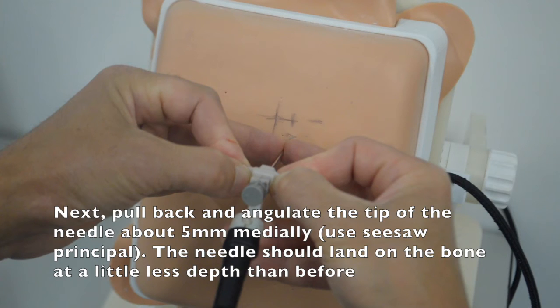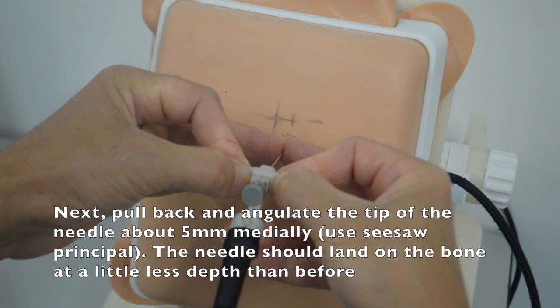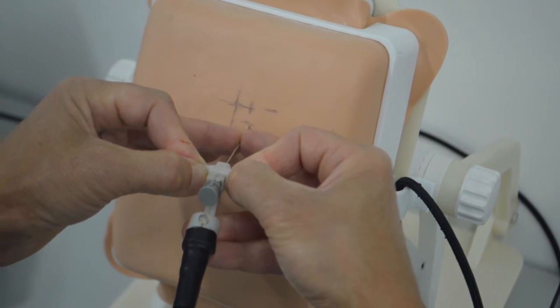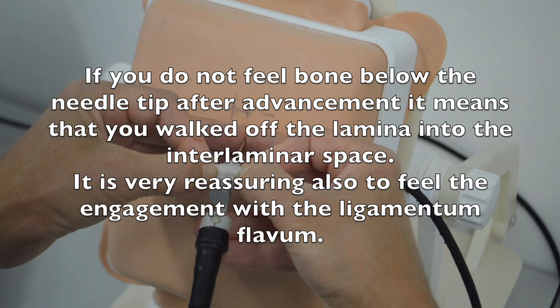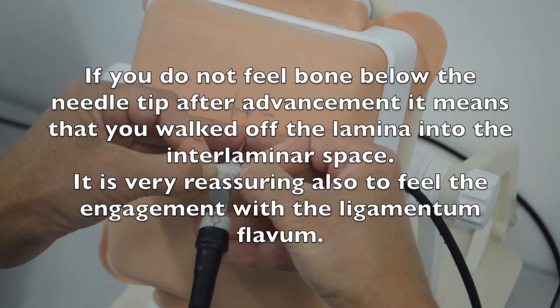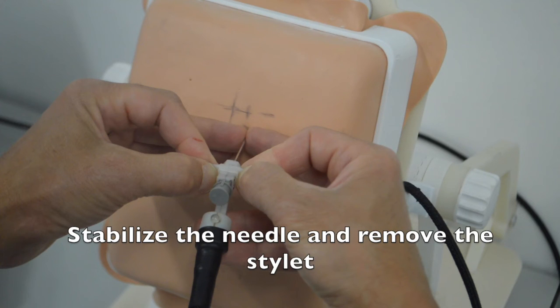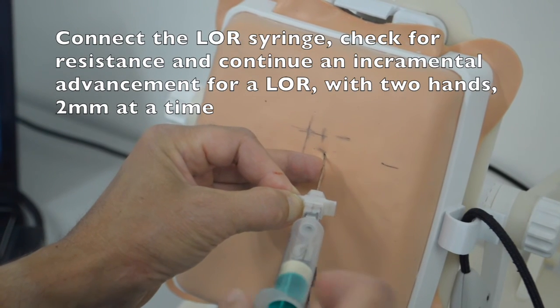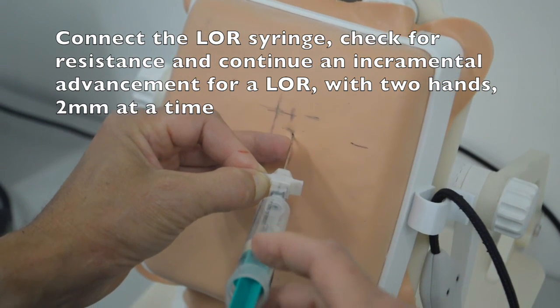Pull back and angulate the tip of the needle about 5 mm medially, using the seesaw principle. The needle should land on the bone at a little less depth than before. Then pull back and angulate the needle tip a few millimeters up. If you do not feel bone below the needle tip after advancement, it means you walked off the lamina into the interlaminar space. It is very reassuring to feel the engagement with the ligamentum flavum. Next, stabilize the needle and remove the stylet. Lastly, connect the loss of resistance syringe, check for resistance, and continue incremental advancement for loss of resistance with two hands, two millimeters at a time.